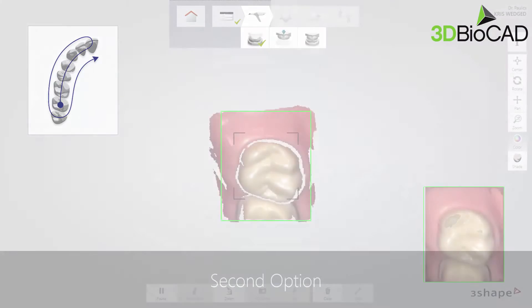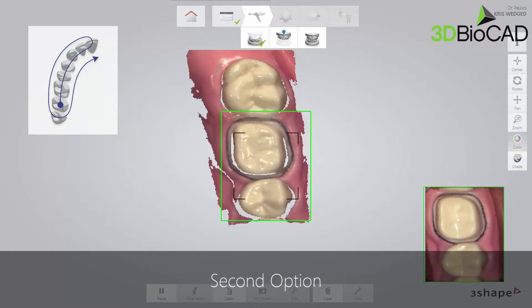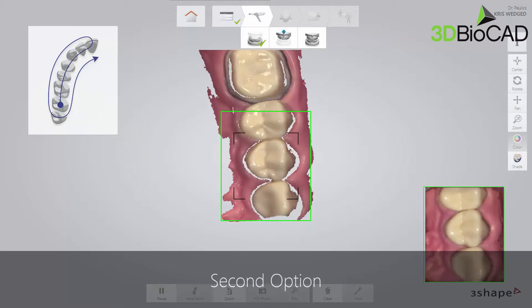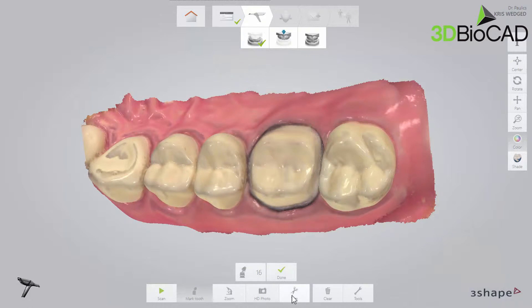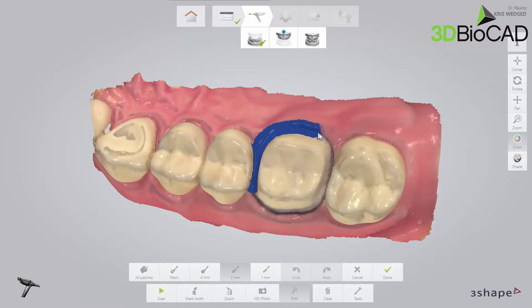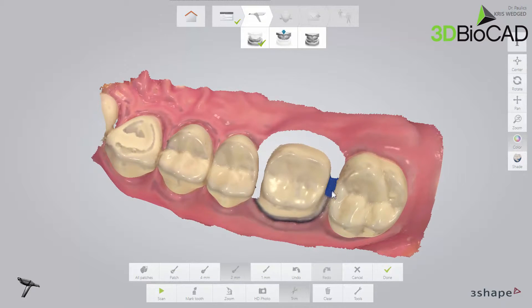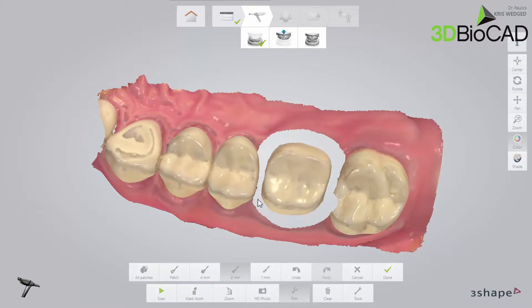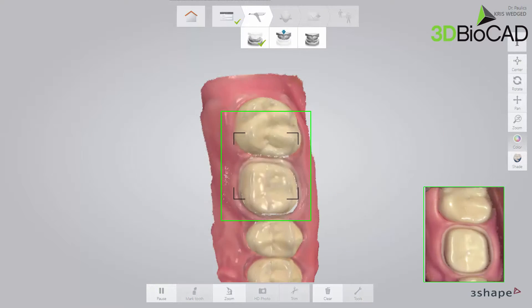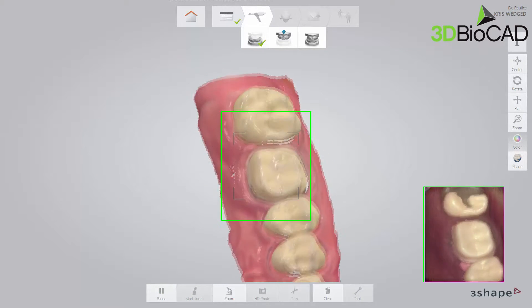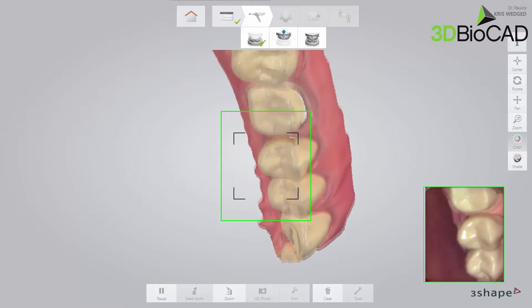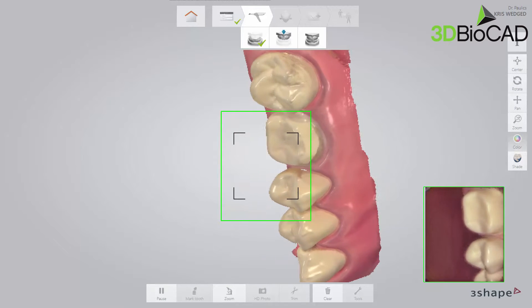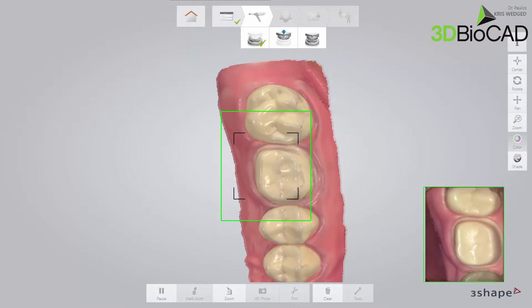The second option is to leave the retraction cord in place and scan the arch following the scan strategy. Then trim away the margin in the scan with the Trim tool. Remove the retraction cord, dry the teeth, and scan the margin immediately before the gingiva collapses. No matter which method you prefer, make sure that you cover the prepped area entirely, including the margin line and contact points.